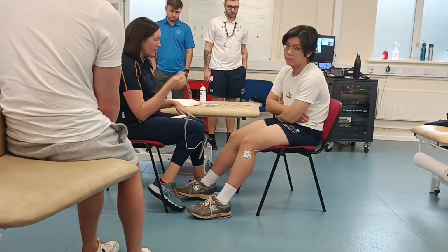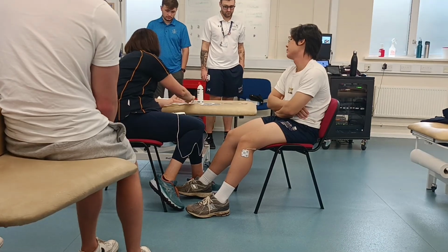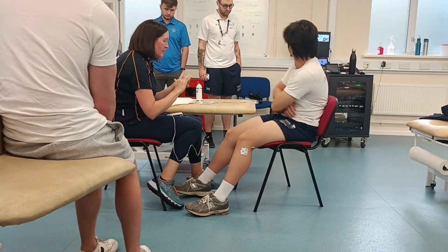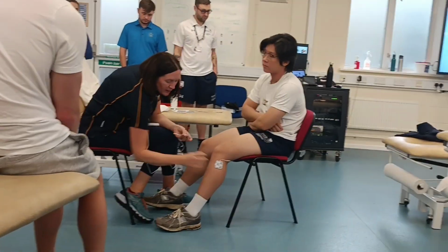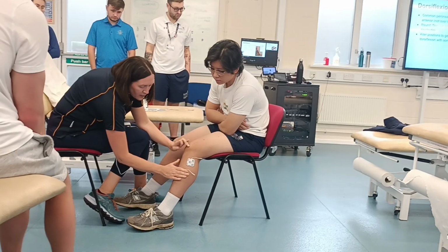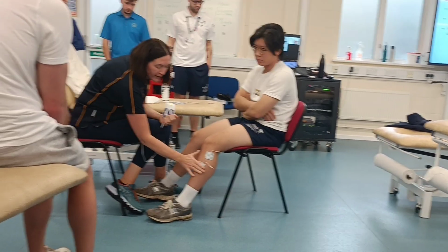Okay. And then my other electrode is going to go on the motor point of tibialis anterior, which just means the main part of the muscle belly of tibialis anterior. So down on the shin. I'm not going to go over the bony bit of the tibia. I'm just going to go on the muscle belly here. Okay. Generally, I put my electrode leads so they're pointing up, so that when a patient's sat with it, the electrodes are more likely to stay on.